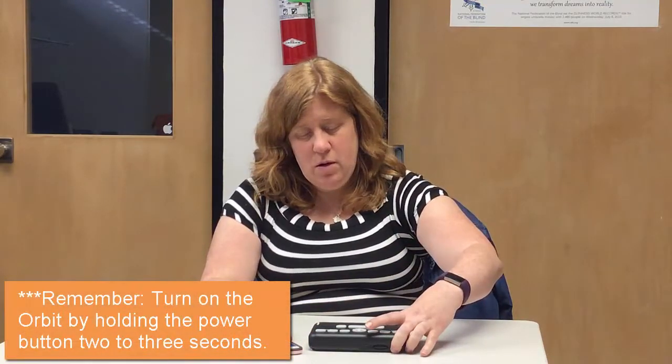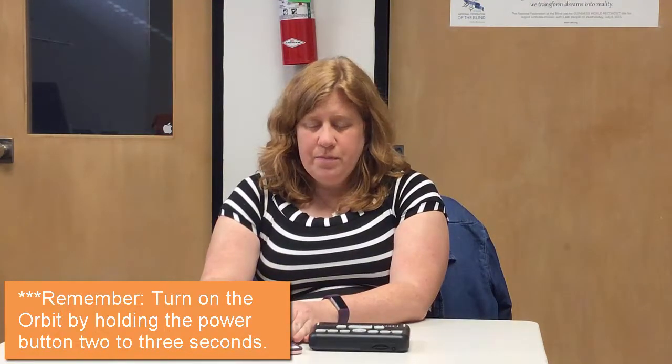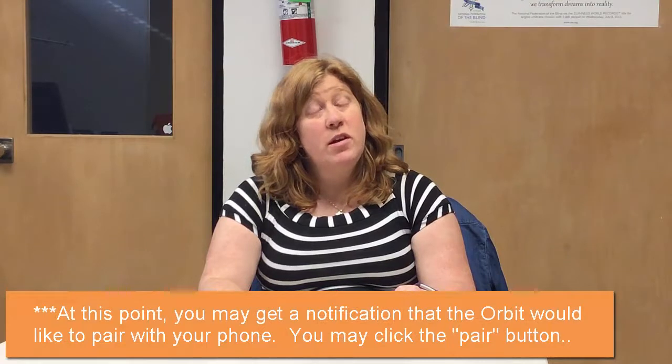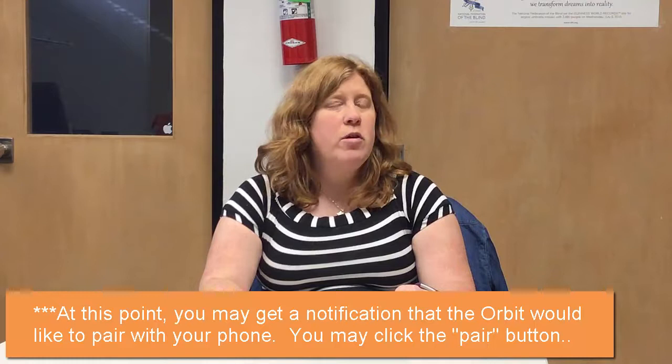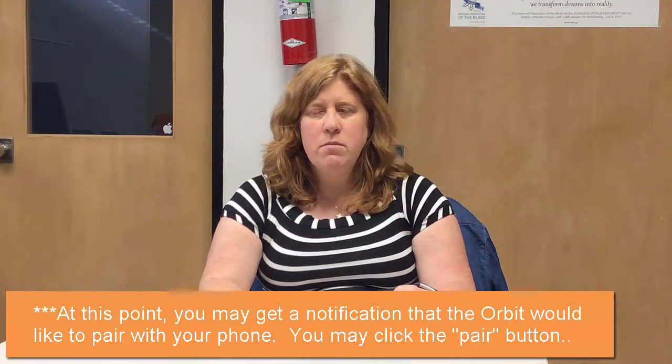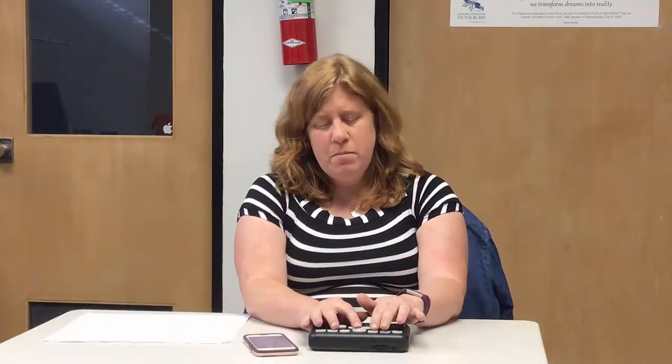Now that the Braille settings are open, we're going to go ahead and try to pair the Orbit. So first we have to turn it on. We're still in the Braille heading. A lot of times it will send the request — it wants to pair. So we want to go ahead and allow it to pair. We're going to double tap on Pair. So now my Orbit may or may not be paired.